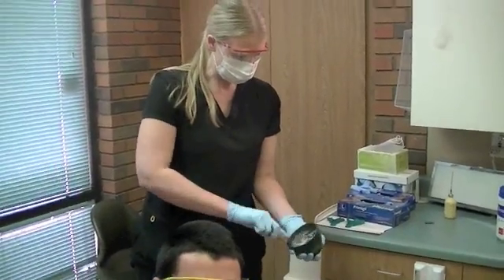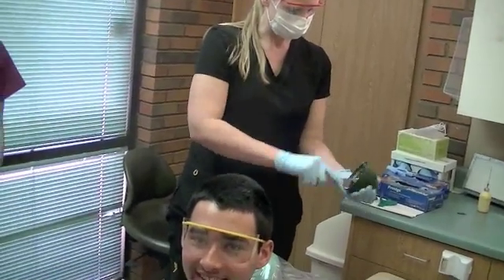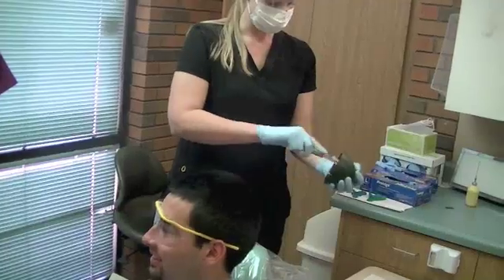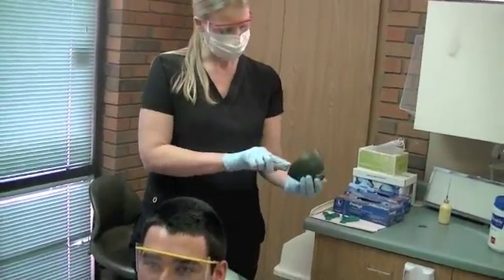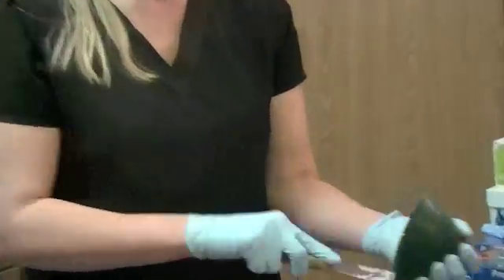The business about getting the lip — you usually get the lip up out of the way. You don't want this, because they'll tense their lip up again and then you end up with the impression going only right through about that point there, and it may not be useful to us depending on what we want to do with that particular model.